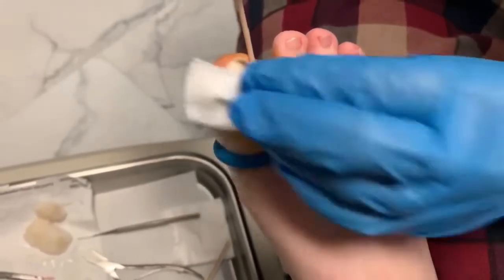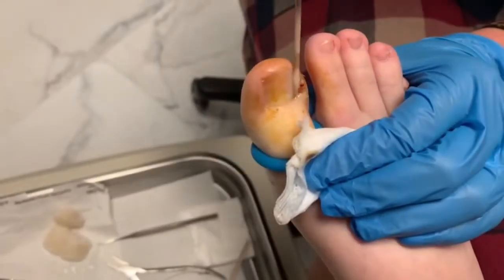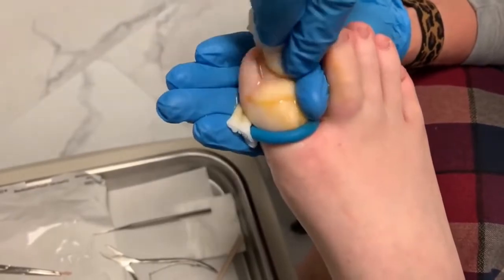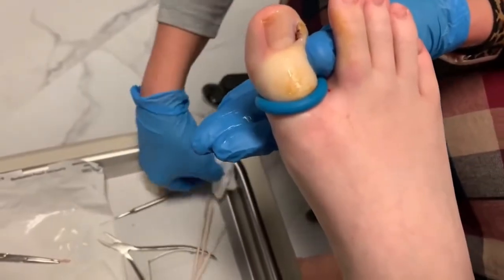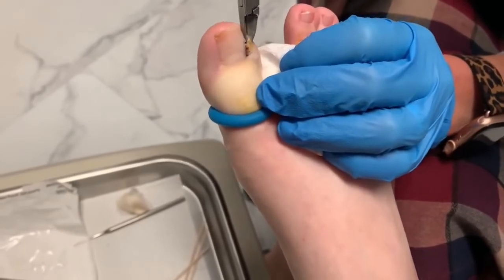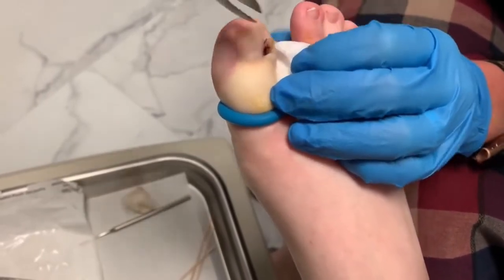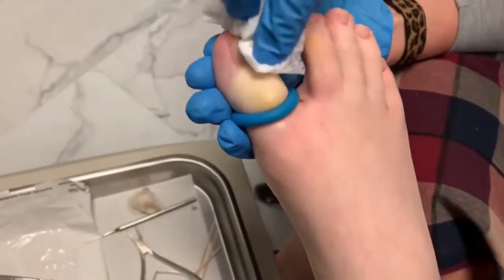Any questions on how to take care of this after we're done today? Let's clean it up a little and then I'm going to trim off the granuloma — that tuft of skin — so we can get you a pretty nail right away. These granulomas like to bleed; that's how it grows. It's basically extra skin. Don't try this at home.